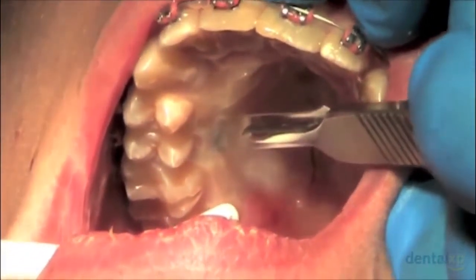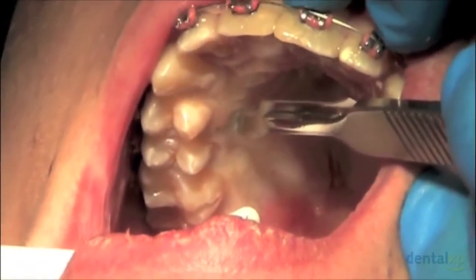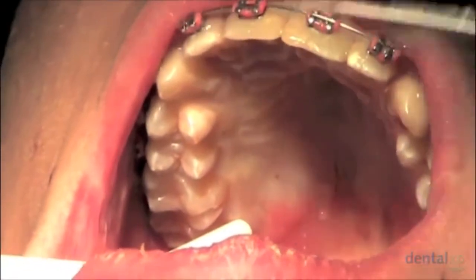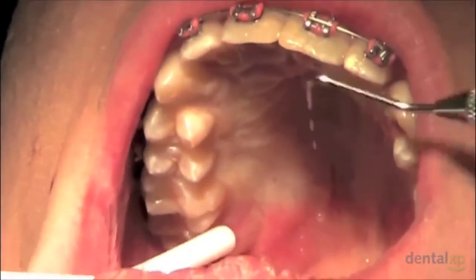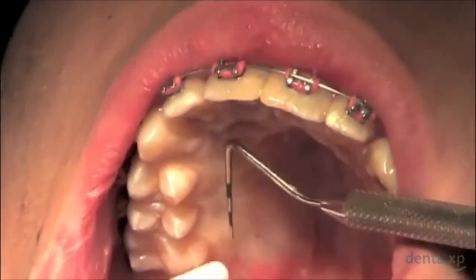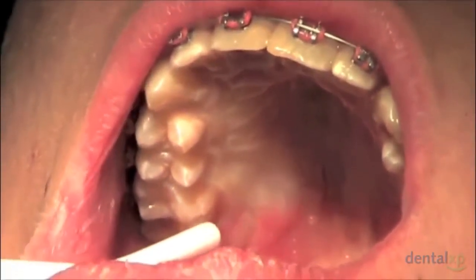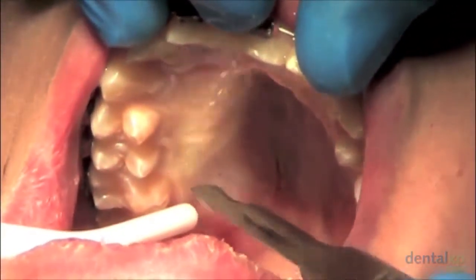The initial incision is carried out with a number 15 blade, which is initiated at about 3 millimeters apical to the free gingival margin, and usually will extend somewhere between the middle of the first molar to the distal of the canine. Obviously, this can be modified depending on how much tissue is required to treat the mucogingival defects in question.